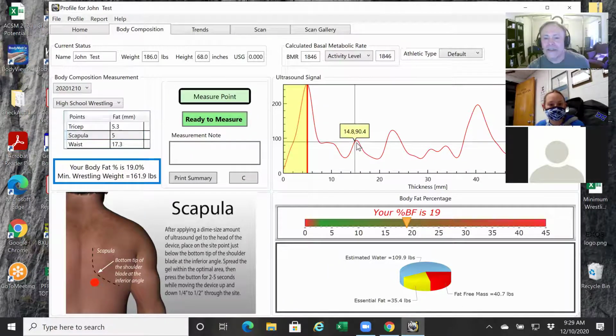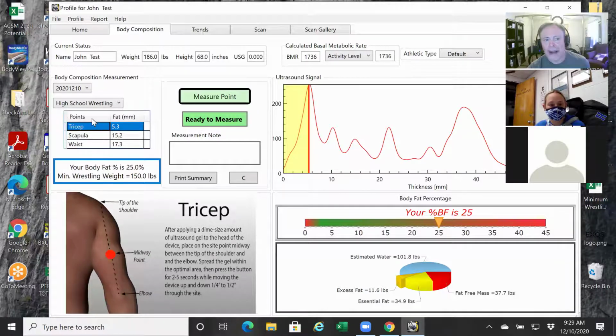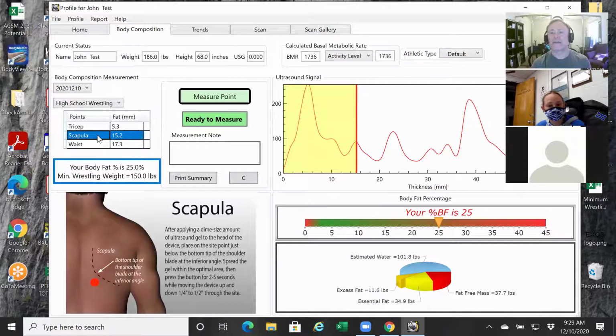Okay, so hypothetical. Let's pretend, I'm just going to move this peak. I just clicked on a different peak down the scale here. Let's pretend I'm your athlete and we just got done and we're analyzing these graphs. We look at the tricep, first strong peak was selected, we're good. We'll go to the next one. Right away, guys, this should be a red flag for a couple different reasons. Just visually speaking, when we look at the graph, we notice that that red vertical line is on a different peak. It didn't recognize for whatever reason, and a lot of times it's attributed to bad technique, okay? Not always, but a lot of times. So we would need to make an adjustment to this graph.